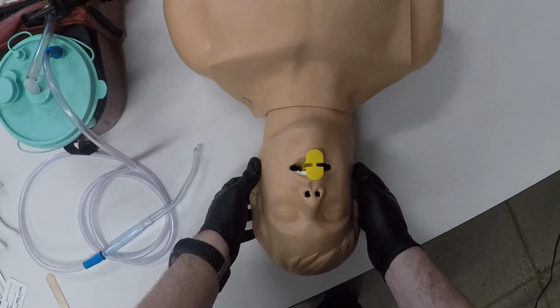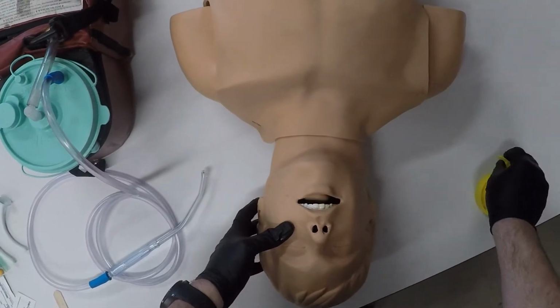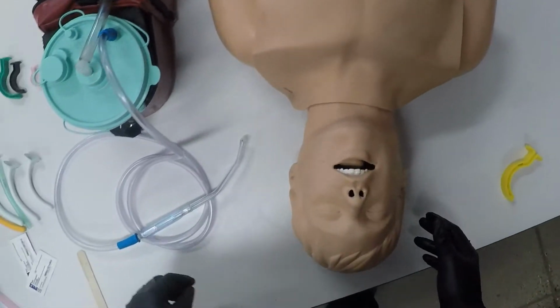My patient is now gagging, so I'm going to remove the OPA. I would consider placing this patient into the recovery position on his side as needed.